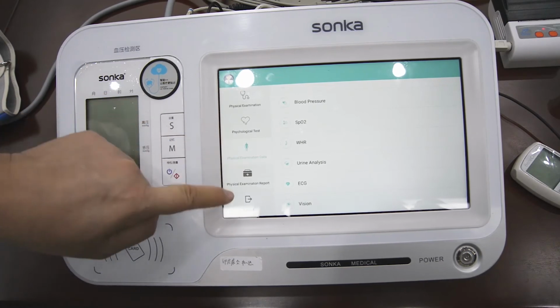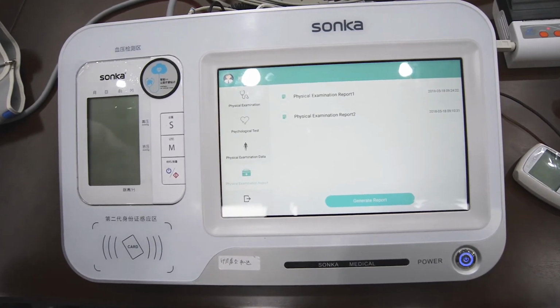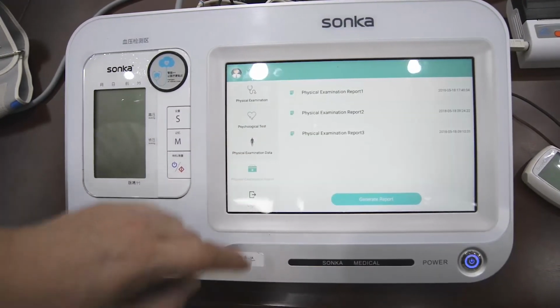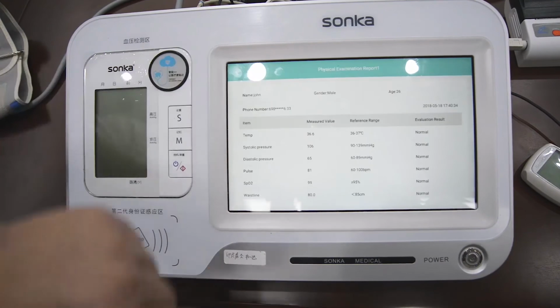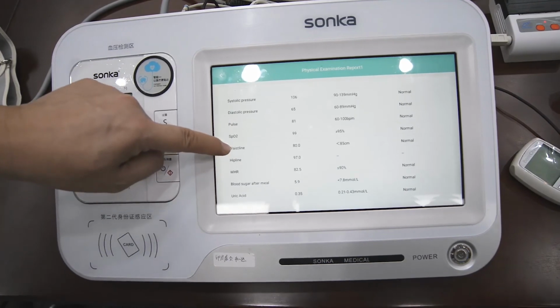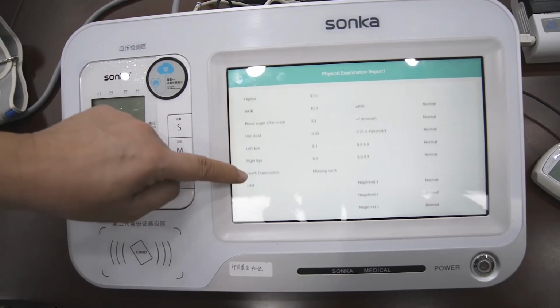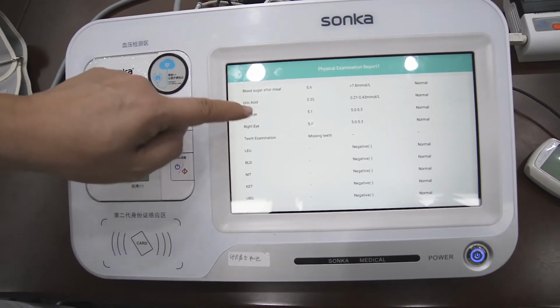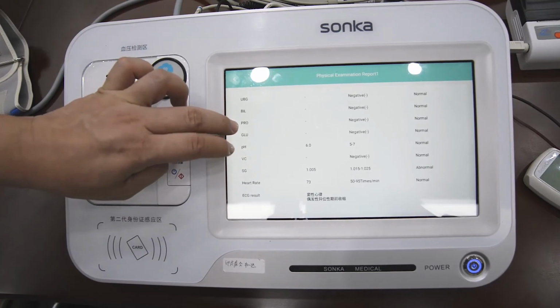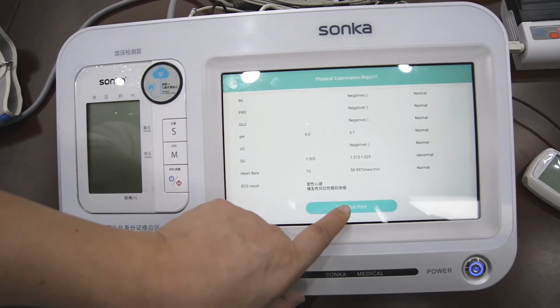And now we go to this option. This is the report. Does the doctor need to create a report? Click the button, choose OK, and choose either one. You can see the data of this time: temperature, blood pressure, blood oxygen, WH ratio, blood sugar, uric acid, your eyesight, and this is related with the urine, heart rate, and ECG result, and click print.